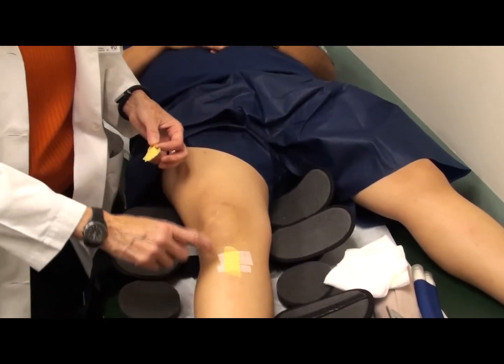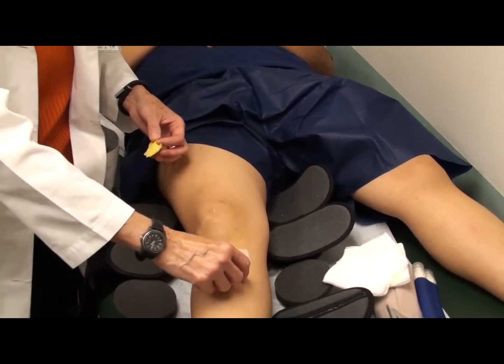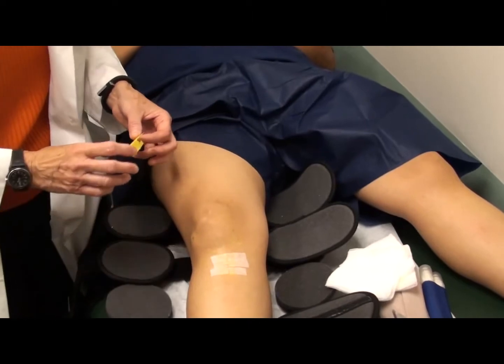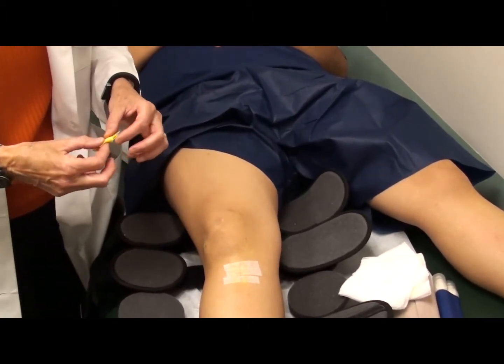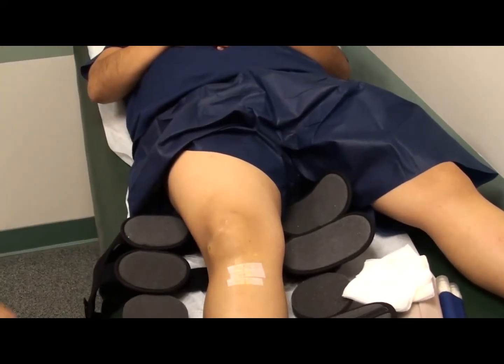And if you had a ligament reconstruction, you'll have another smaller incision down on your shin with these Steri-Strips in place. So take off the yellow gauze, but leave the Steri-Strips in place because they're holding your skin together. Don't remove those. If you do, your skin may tend to spread a little bit and you may end up with a wider scar.